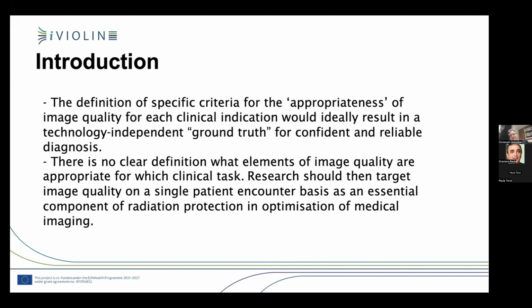What do I mean by that? It should not matter whether you have a CT from vendor A or vendor B, or whether you have a 10-year-old CT or a 2-year-old CT, with all the technical new developments. You say what you need for a clinical indication. The image quality that is appropriate for your diagnosis should not depend on which system you are using. If a certain scanner does not allow this, then you should use another scanner if possible.